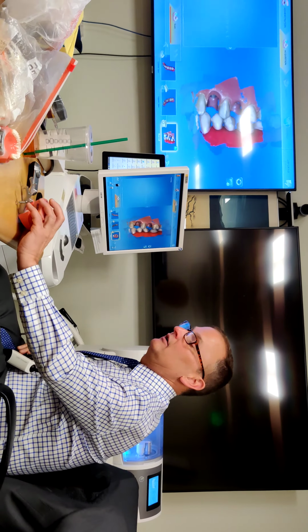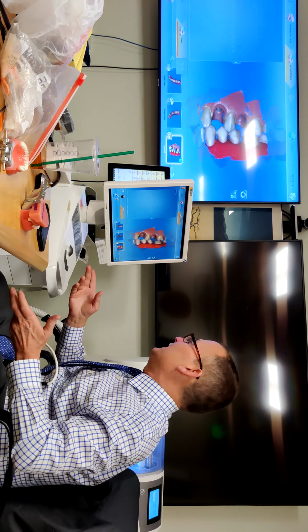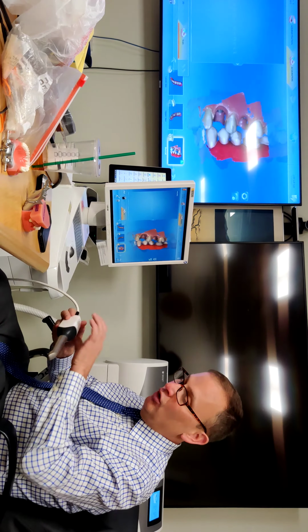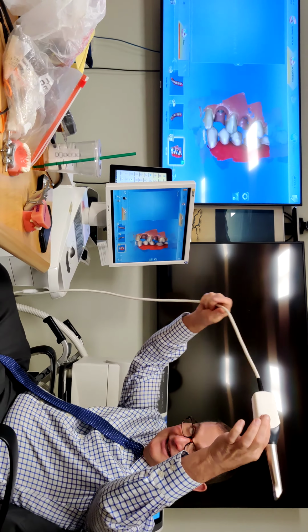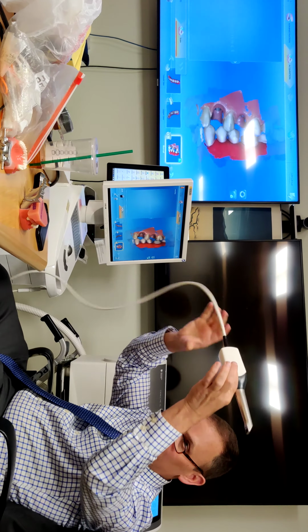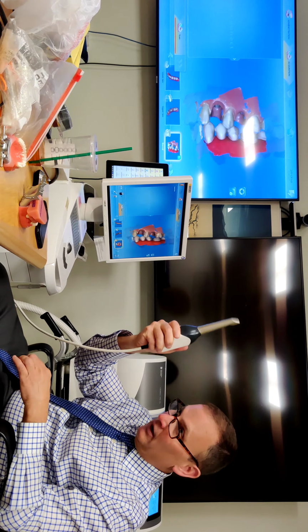Okay, we're done, other than I haven't got the intraoral scan body. Now, you're seeing me do a bad thing. I'm holding this in my lap. This right here, assistants, is $5,000. You drop it, and it's probably $5,000 ruined.